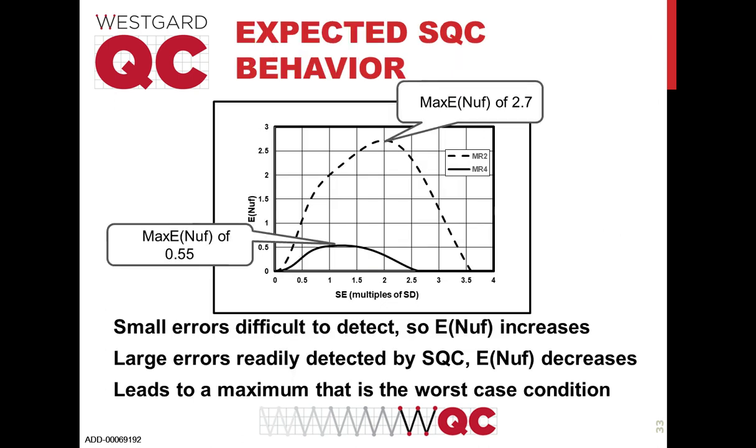And it creates a bunch of risk curves. And these risk curves are a little exotic. You've probably never seen them before, but we'll just take a quick look at them. Along the x-axis is the size of the error. Along the y-axis is the number of patients who are going to be at risk of getting a wrong result. And these risk curves all start at 0 because if we have no analytical error, there are no patients at risk. I think we can all agree about that.